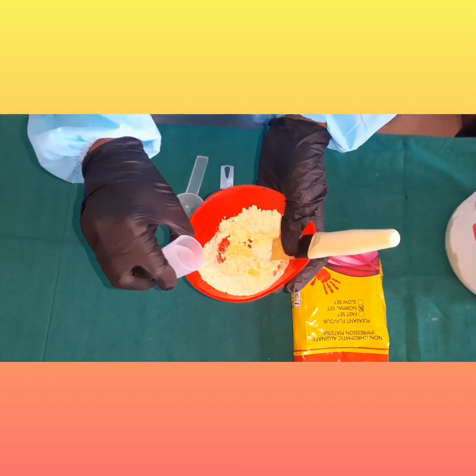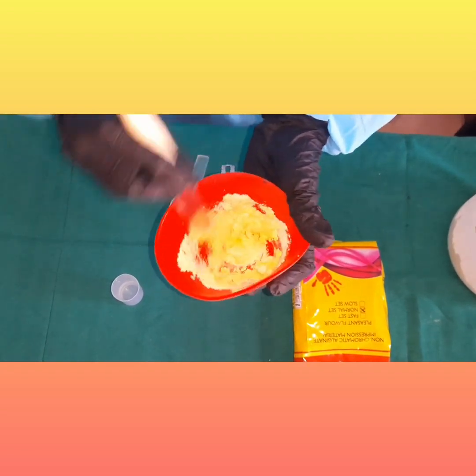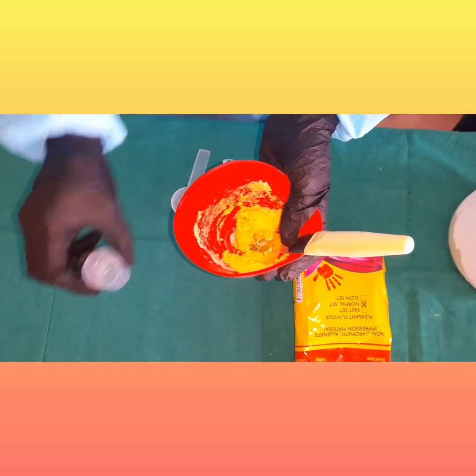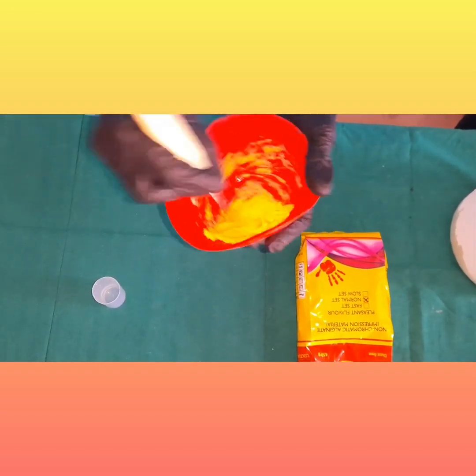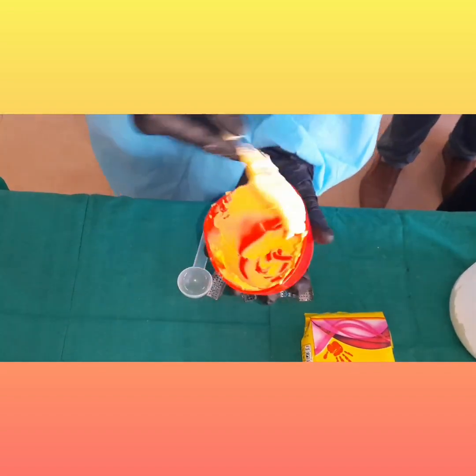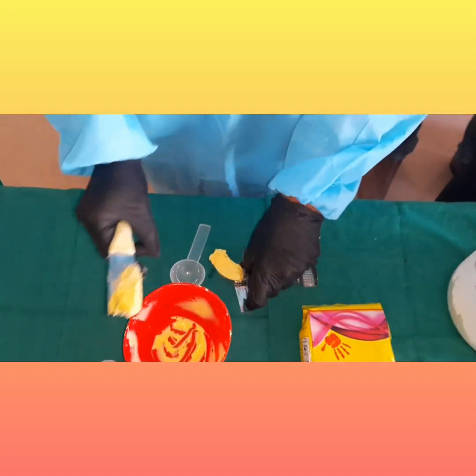Just make sure that you wet the powder particles. Then with the curved part of the spatula, strop against the walls of the bowl and make a figure-of-eight motion so that you have a smooth, homogeneous mix that is easy to manipulate in the patient's mouth. This is a good smooth homogeneous mix — load it onto the impression tray. You have to be fast, because otherwise your working time with the material will reduce.